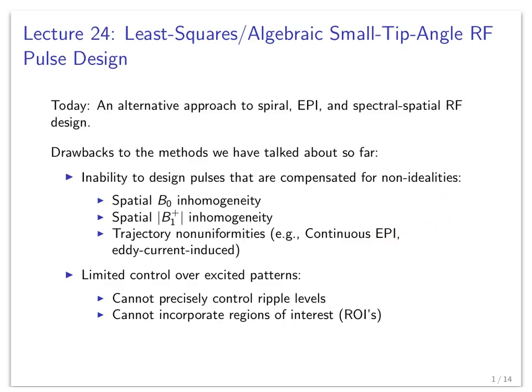That was a result of the non-Cartesian scanning of k-space. We were implicitly assuming when we designed the pulse that we were scanning kz-kf space in a raster manner, but in fact we have this zigzag pattern, and that induces these non-idealities in the pattern. But maybe if we had a better approach to designing the pulses, we could compensate for that non-uniformity.